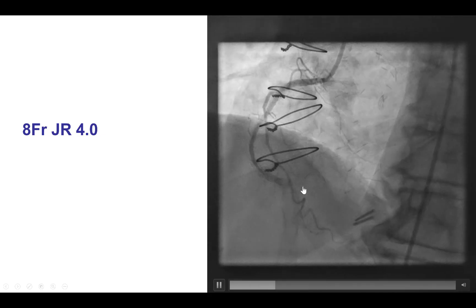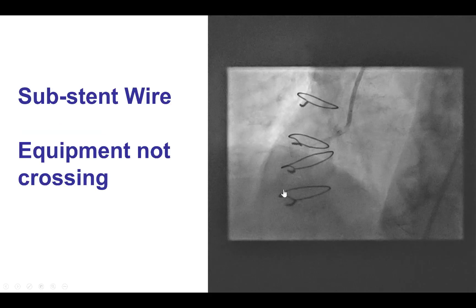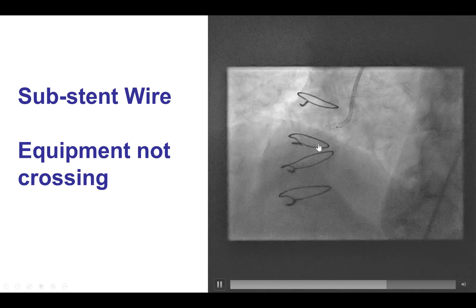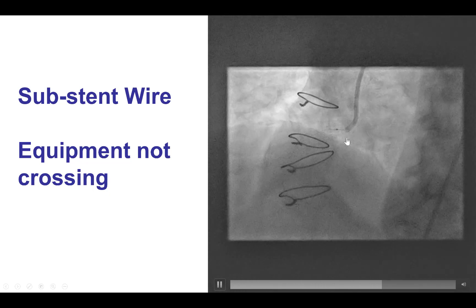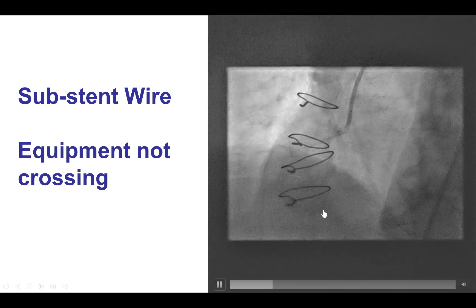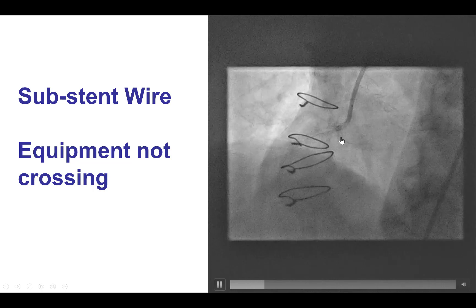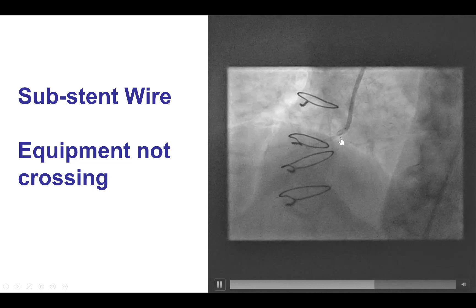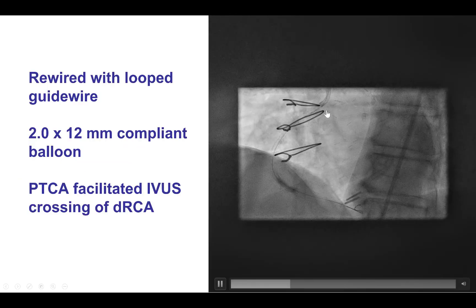There was already severe in-stent stenosis of the distal right coronary artery. We wired the vessel but then had difficulty advancing balloons through the proximal RCA. This is a vessel that has been stented all the way to the ostium. When that happens, chances are that the wire has crossed under a stent strut, and the solution is to rewire using a loop. This is exactly what we did, and we were then able to easily advance balloons and other equipment to the distal right coronary artery.